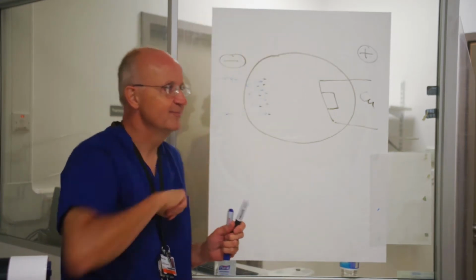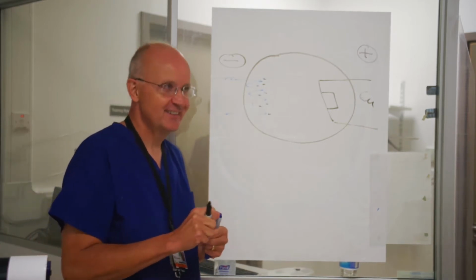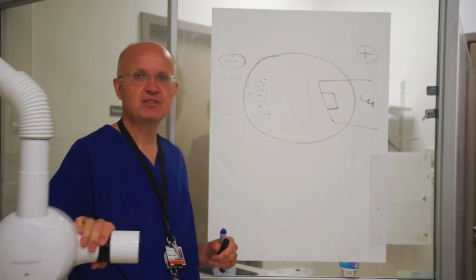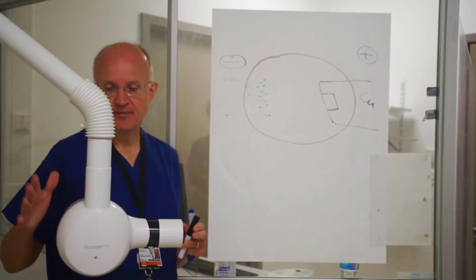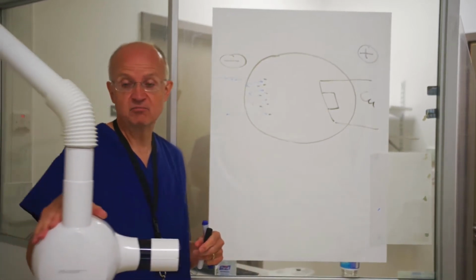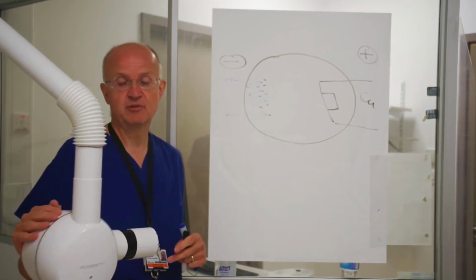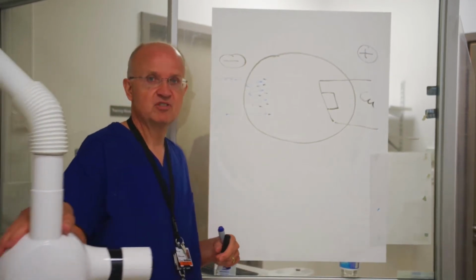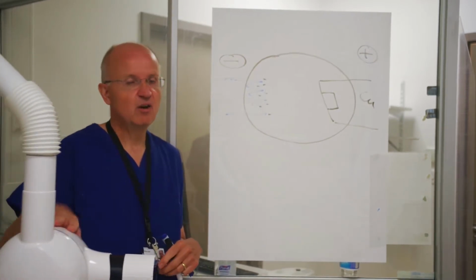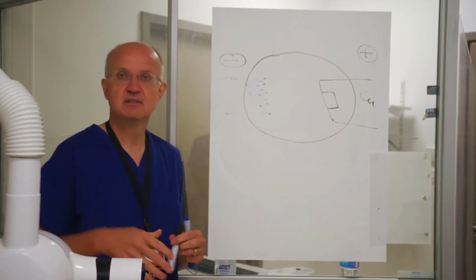Mr. Viner, what's the target made from? So, very good question. What is the target made from? And that is a very good question because X-ray tubes do differ from one type to another. This X-ray tube is designed for producing X-rays at energies that are good for looking at bone and soft tissue generally across the human body. So we want X-rays that are produced in the range of maybe 50 to 100 or so, being optimum around about 70 kV. So we would choose tungsten.